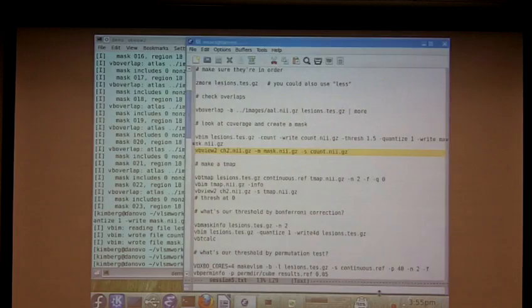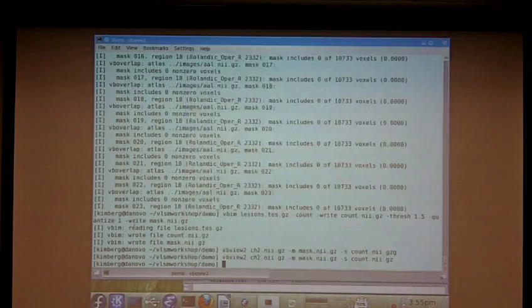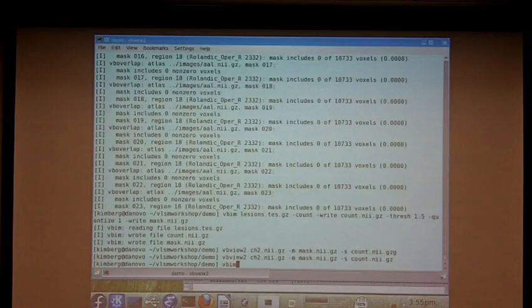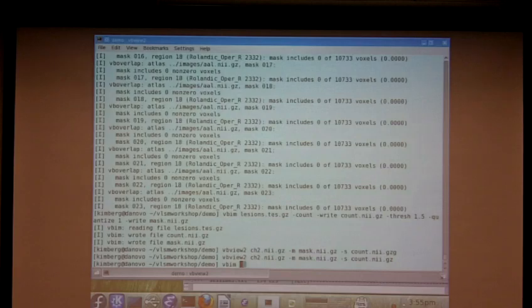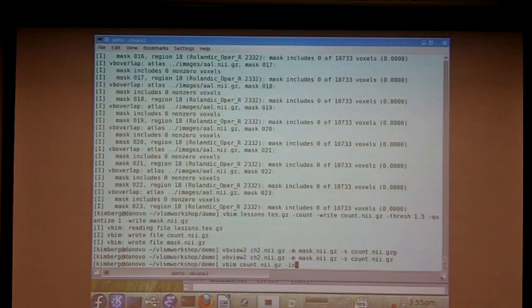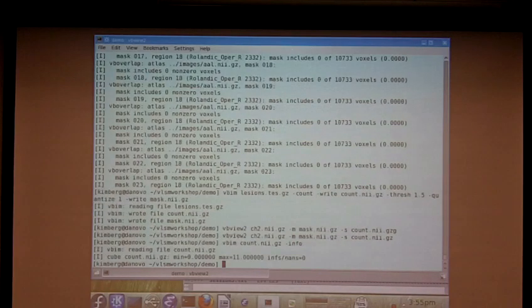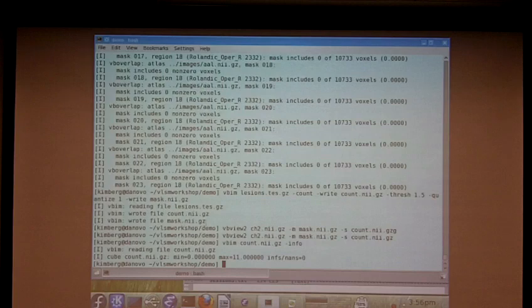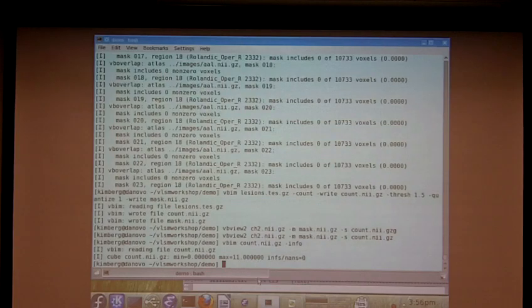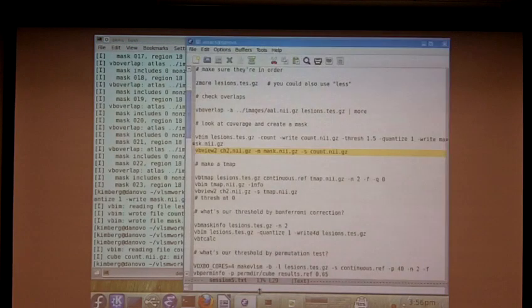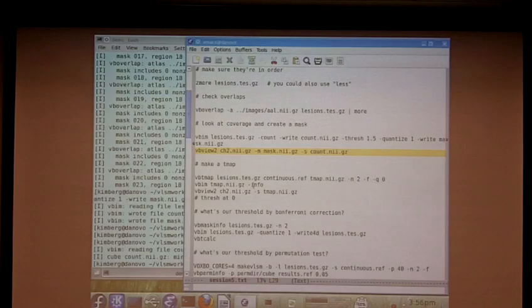I don't know what the maximum is, but we can find the maximum. Let's do it right now. So if I do VBIM count map and I say dash info, it tells me that there's as many as 11 lesions in a single voxel. That's our maximum.